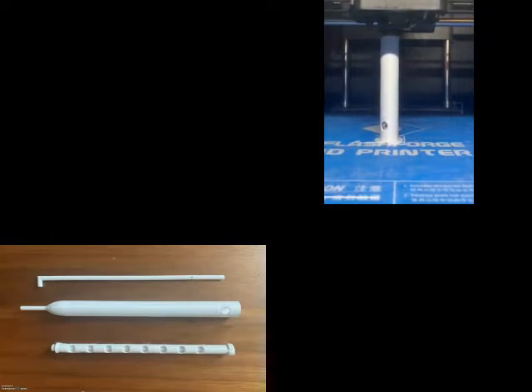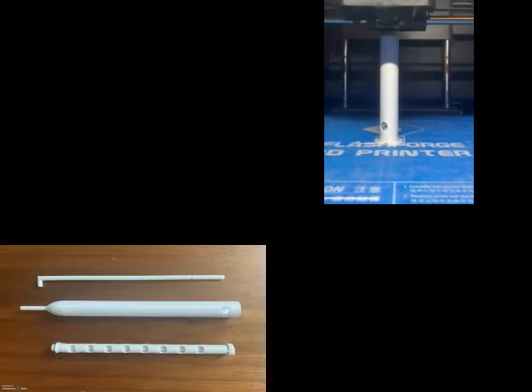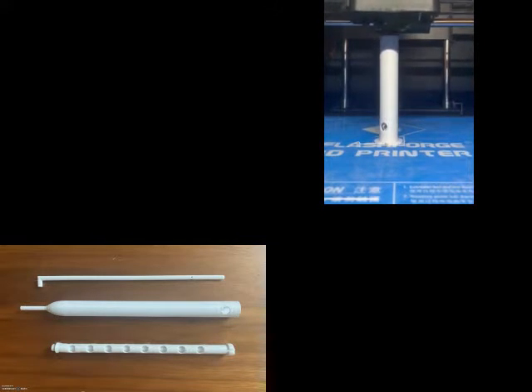The mouse stylus was 3D printed using regular PLA plastic. It was printed in many different pieces, however, these are the three main components. Along the bottom is the inner tube with its several different notches for different settings. There is the outer tube in the middle, and then the clip is along the top.